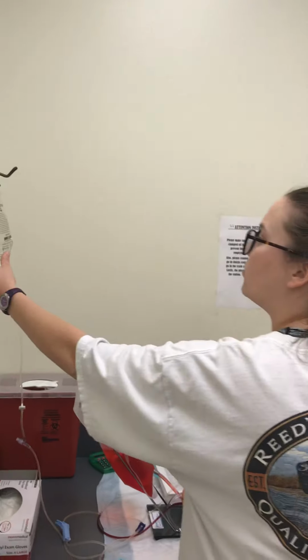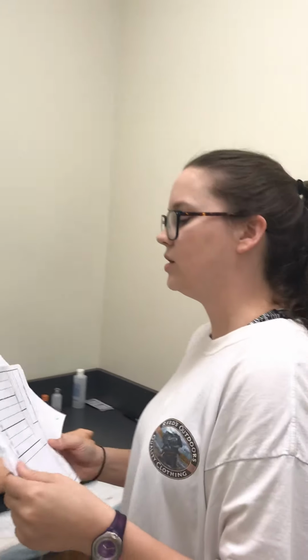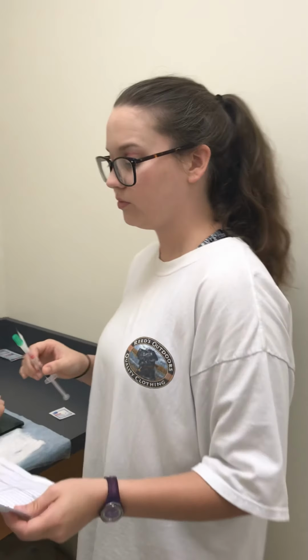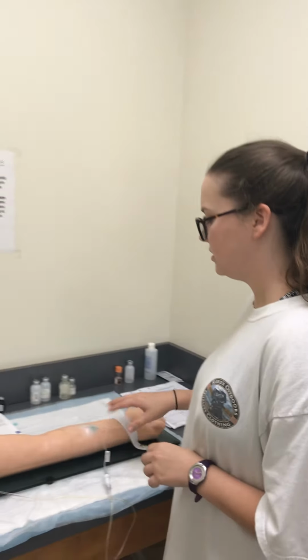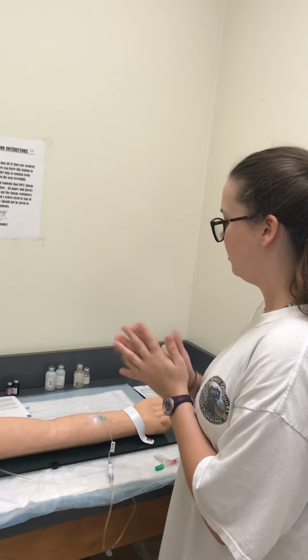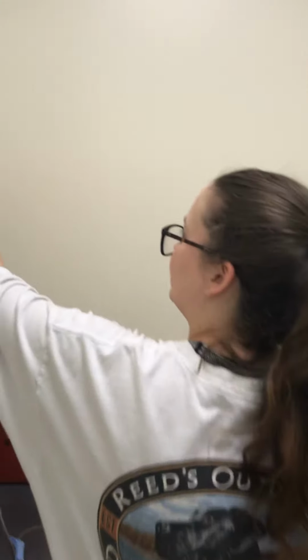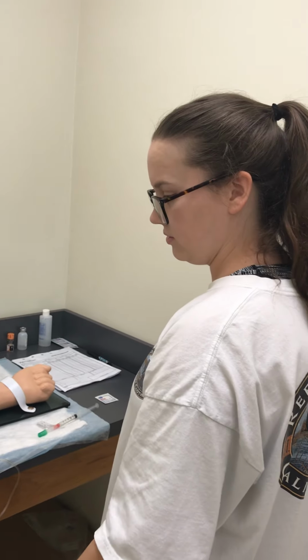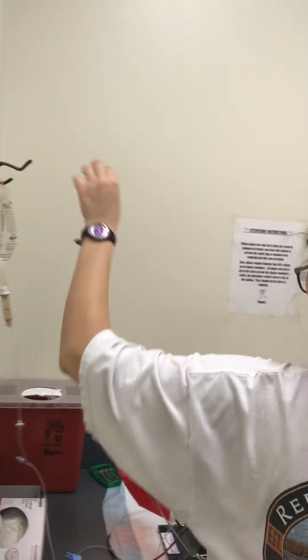Checking my solution hanging up on the wall, checking expiration and clarity. It's normal saline, and as we know, that is compatible. And one last check with my Solu-Medrol and my MAR. I'm going to assess the site, make sure there's no redness or warmth or irritation. Now I'm going to lower my bag to check patency. And I saw blood return, so I know it's patent.